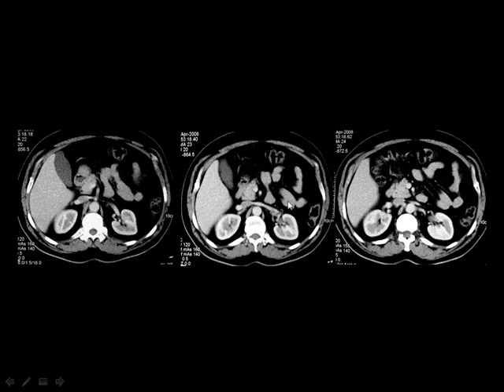Then if you look carefully in this particular area, you see bowel loops, but you see this structure, which is the pancreatic head. How can you know that this is the pancreatic head? By these two anatomic landmarks. There are two small dots, one is smaller than the second, and this is the artery, this is the vein, the superior mesenteric artery and the superior mesenteric vein.